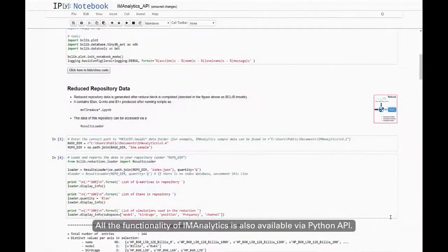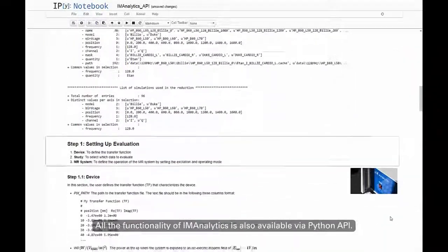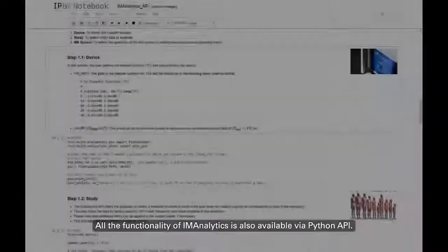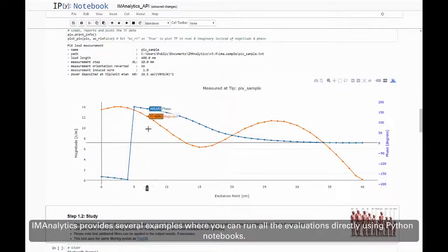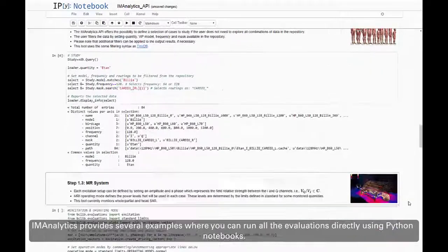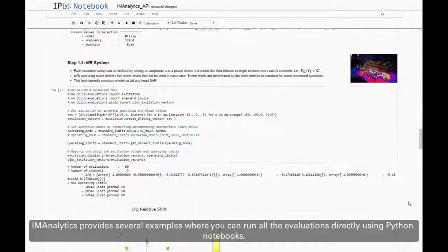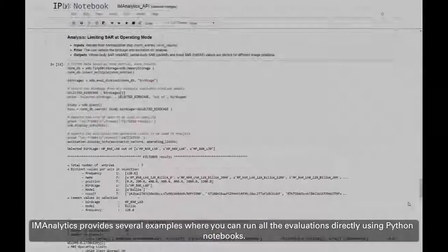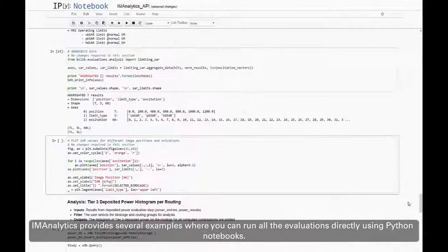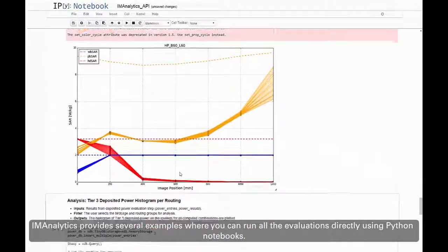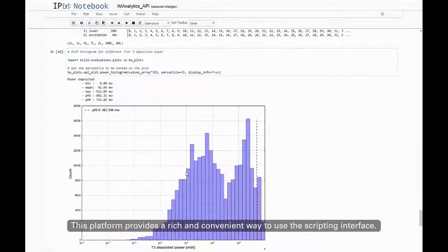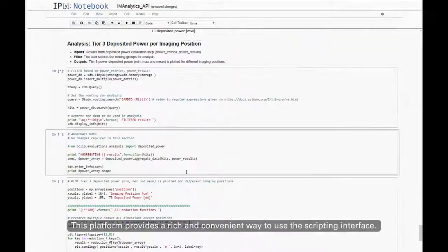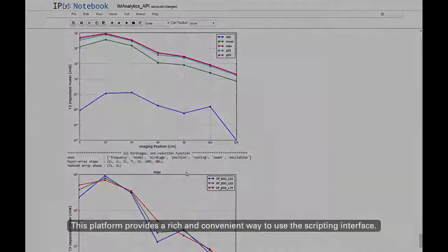All the functionality of IM Analytics is also available via a Python API. IM Analytics provides several examples where you can run all the evaluations directly using Python notebooks. This platform provides a rich and convenient way to use the scripting interface.